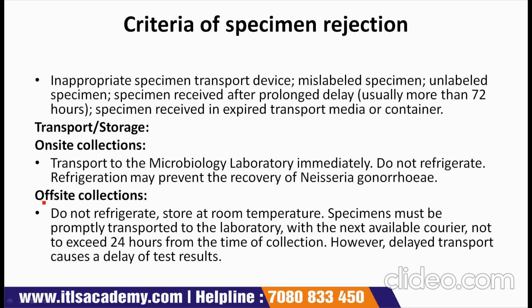In the case of off-site collections, do not refrigerate, store at room temperature. Specimens must be promptly transported to the laboratory with the next available courier, not to exceed 24 hours from the time of collection. However, a delayed transport causes a delay of test results.